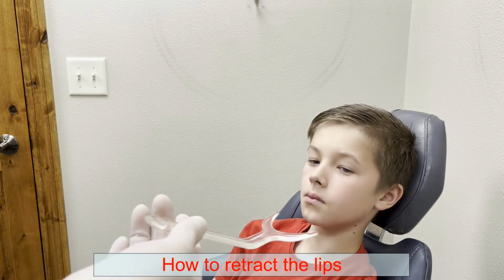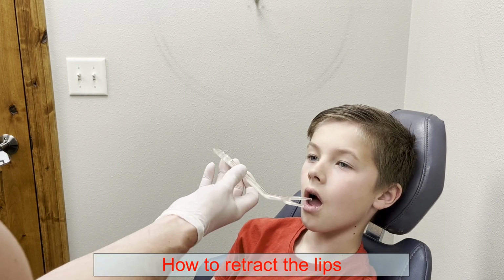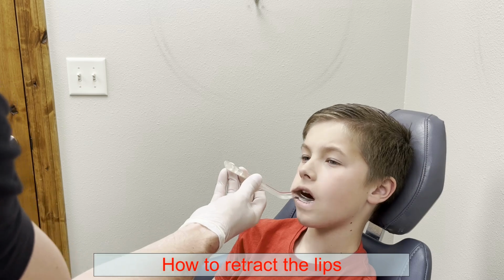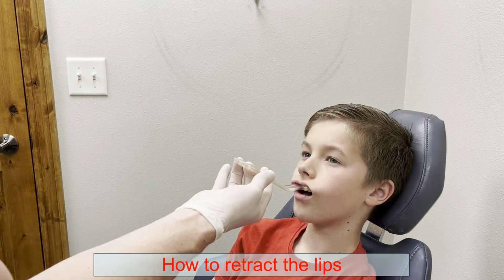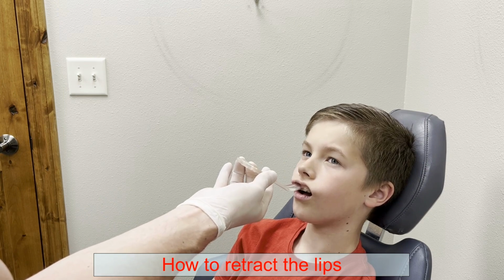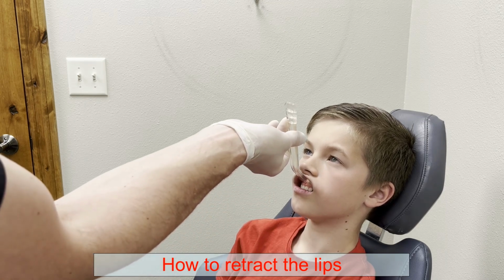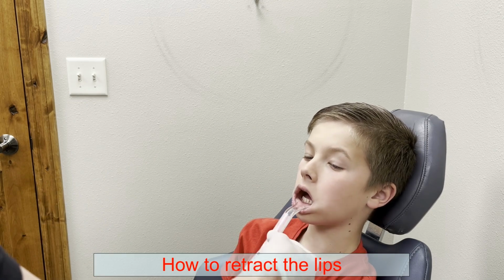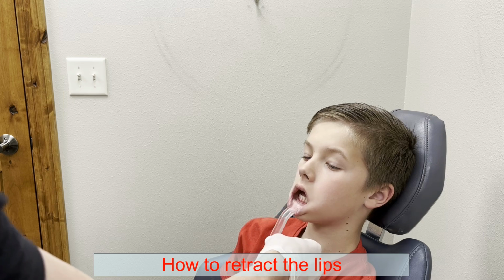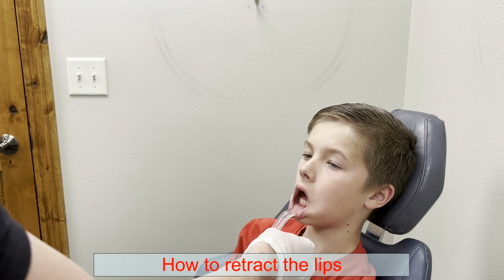Okay, so this cheek retractor, or lip retractor, you just have them open wide and you put it in kind of like an impression tray like this, and then you slide it right up here and have them raise it up. People want to do this, but that will not pull their lip back. So you have them hold it at the very end and lift it up high like that. And then on the lower, same thing, you put it in, you have them hold it down here at the very bottom and then hold it way down like this. If they try to do it like that, it's not going to work. They have to hold it down like that.